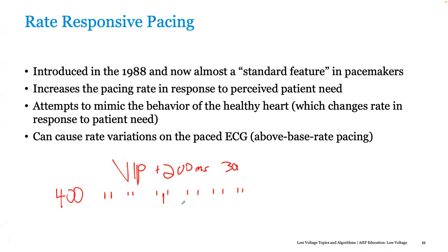I've got a little question. Yeah, sure. Is that MVP mode available on the third generation Medtronic Spheras, or is this a brand new thing? Because obviously in Nigeria, mostly they've just got these Spheras and third gens. Does Julius know or anyone know?